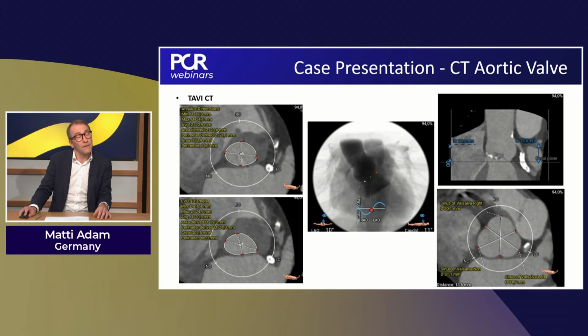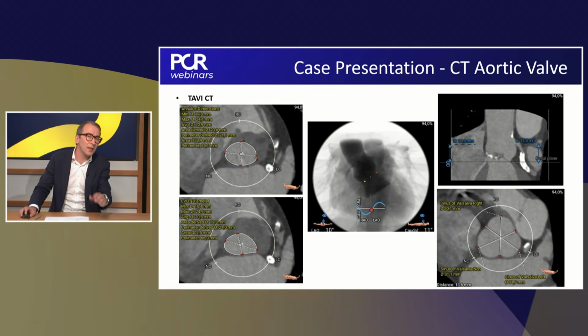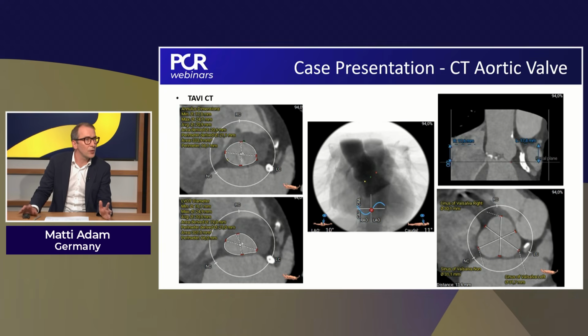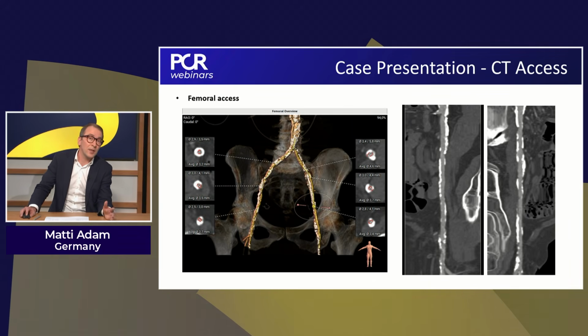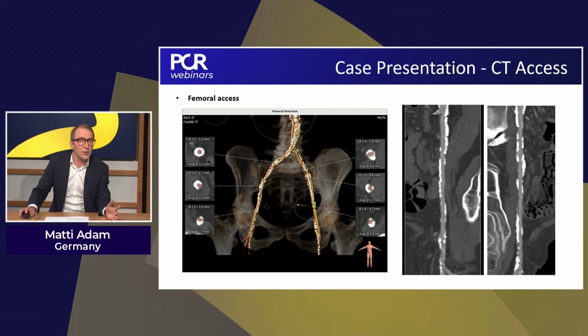But anyway, if I remember well, she was a relatively tall German patient, and this is a relatively small anatomy. True. So yeah, that's also something to take into account. Yeah, it's only 21. You're right. If you look at the eccentricity index, I think it's oval. The minimal diameter, in comparison, especially in the LVOT, to the maximum diameter is a little bit elliptic.